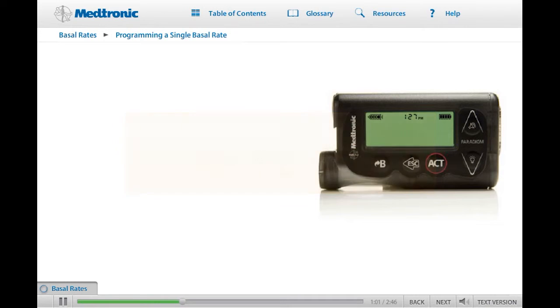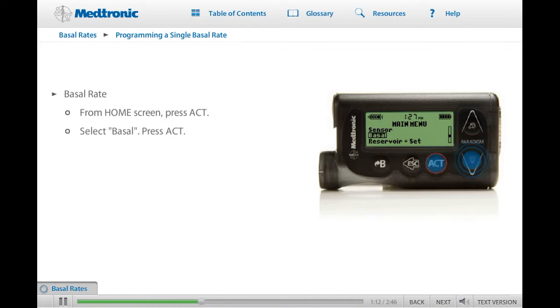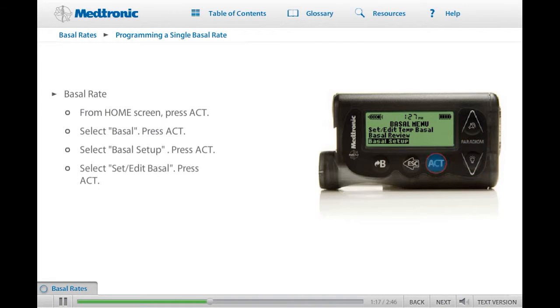To practice programming a single basal rate, start on the home screen and press ACT. On the main menu, scroll down to Basal and press ACT again. On the basal menu, scroll to Basal Setup, then select Set Edit Basal. Press ACT.